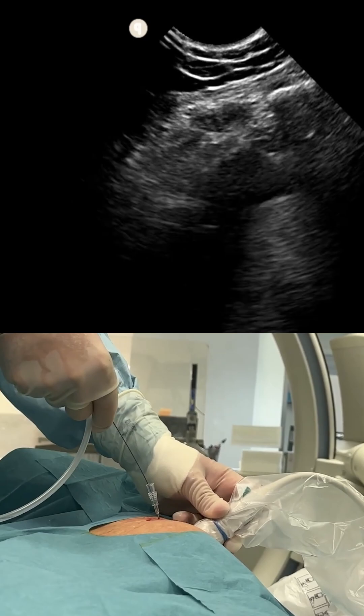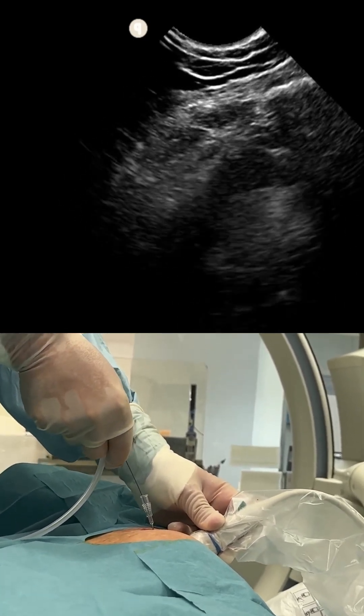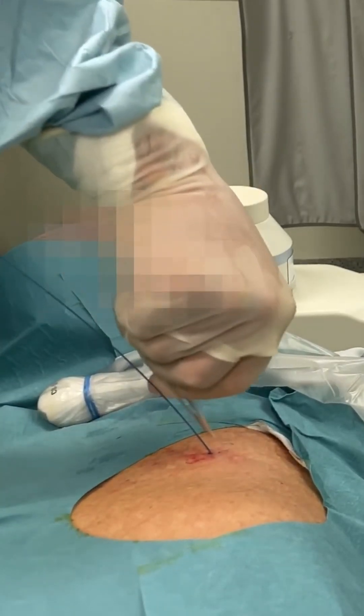When the guide wire is inside the pericardium, some back-and-forth sweeping can be done to remove septa if the fluid has been standing for a long time. Next, dilate and place the pigtail. Note the small skin entry.